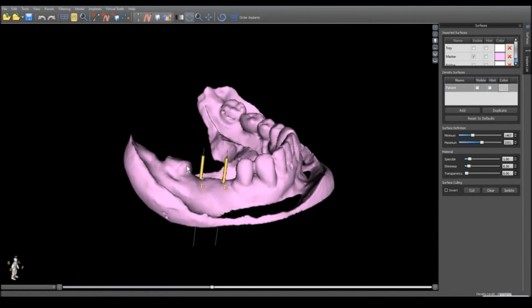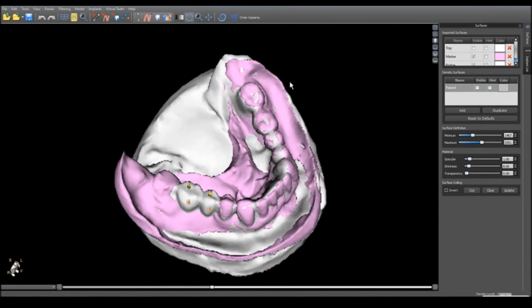This tooth had a resorptive defect and had to be removed. But before the prosthodontist resected the pontics from this bridge, I snapped an alginate.